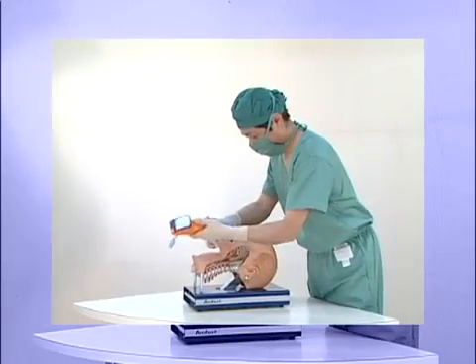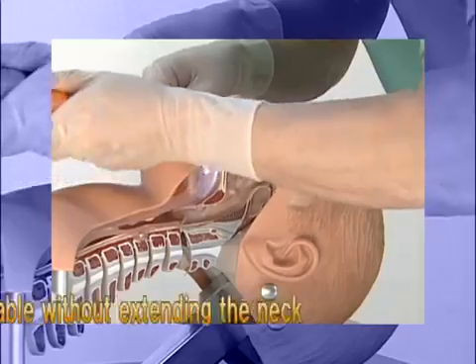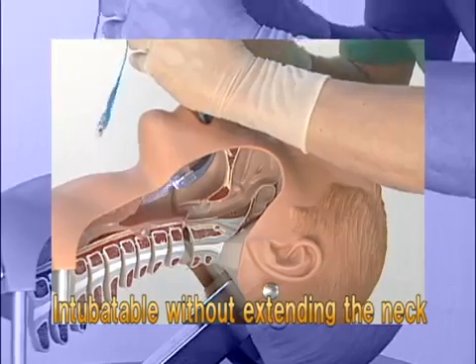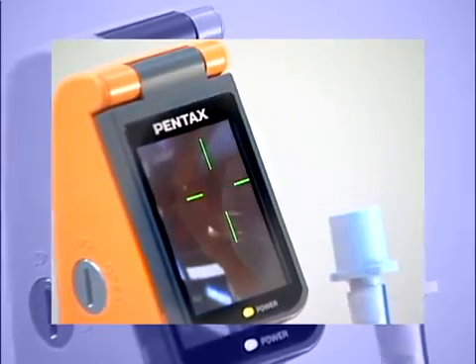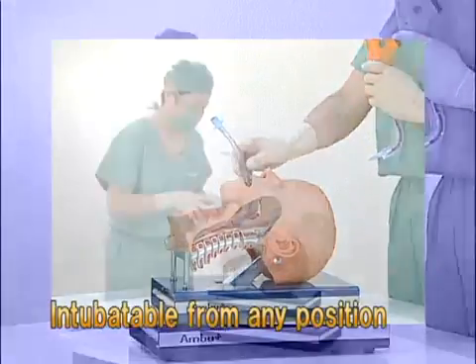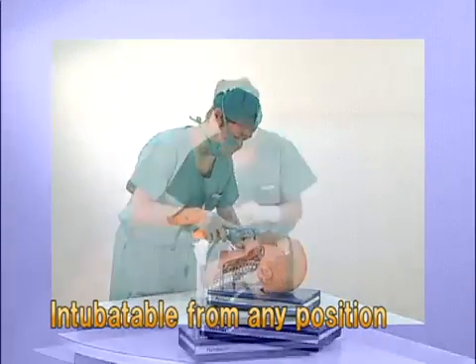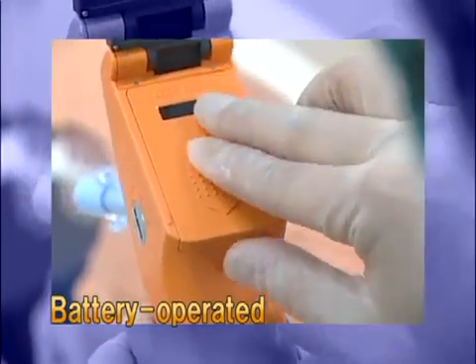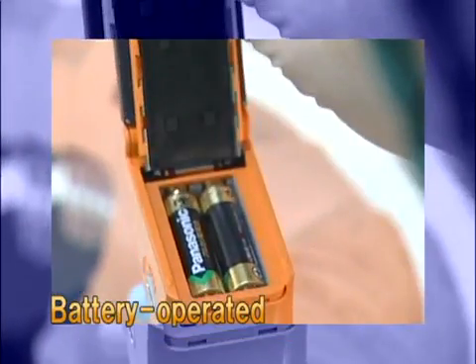The Pentax AWS allows you to perform tracheal intubation without extending the patient's neck while checking images on a monitor. You can perform intubation from any position on a patient. Because the Pentax AWS works with ordinary AA batteries, you can use it outdoors.